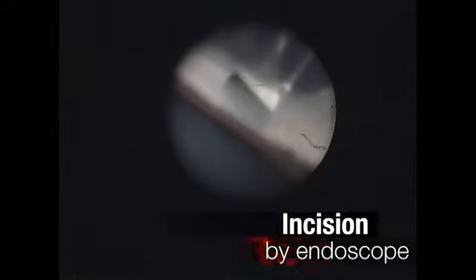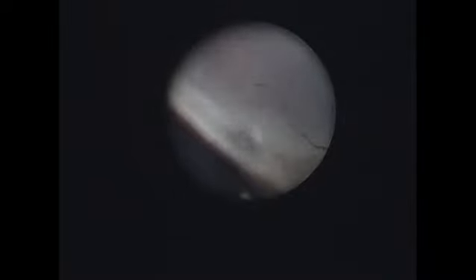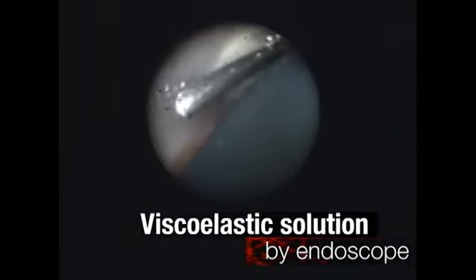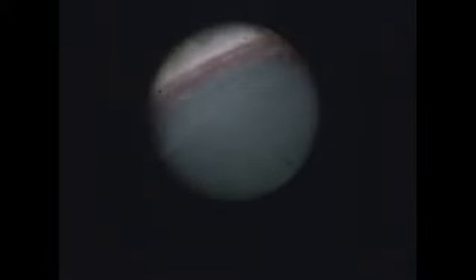Using an endoscope, it is possible to view the incision. We observe the exact time and location that the blade penetrates the cornea. We can identify the viscoelastic substance filling the anterior chamber, thus making it possible to perceive when the anterior chamber is completely filled. The presence of bubbles in the viscoelastic layer facilitates identification.